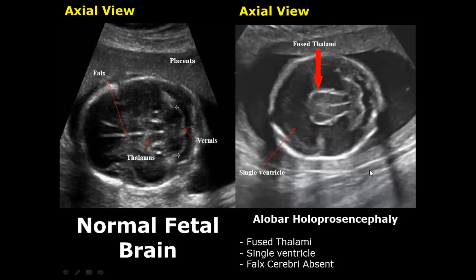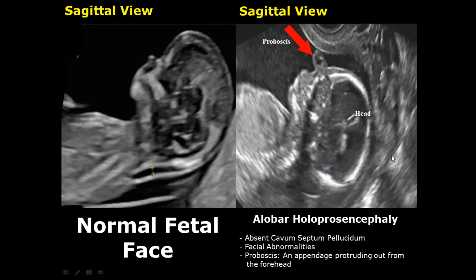Holoprosencephaly is a brain disease with three main types. The first is alobar holoprosencephaly, in which the thalami are fused — you can notice here the thalami are fused, whereas in the normal image they are on either side of the falx cerebri. There is a single monoventricular cavity, and the falx cerebri is also absent. This form is associated with facial abnormalities, one of which is proboscis — an appendage protruding out from the forehead, as shown in this sagittal image.